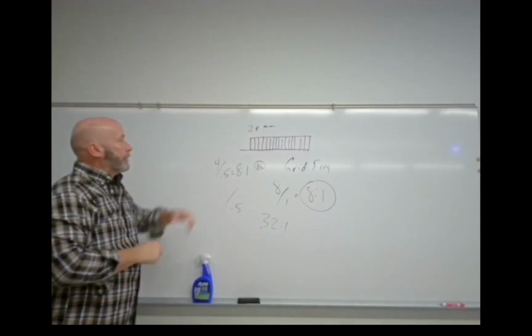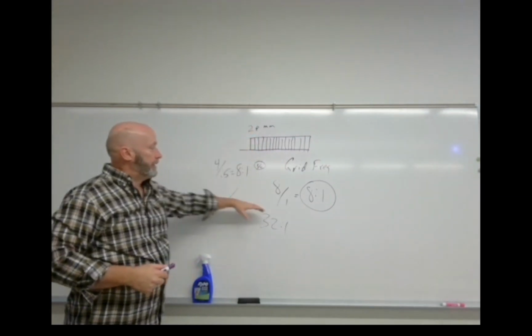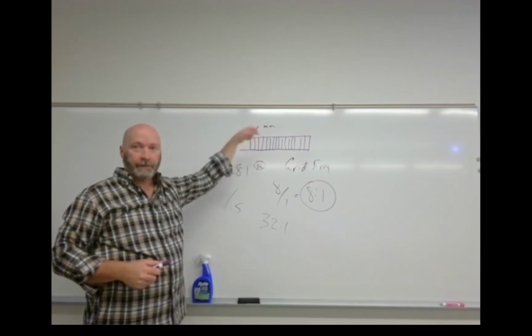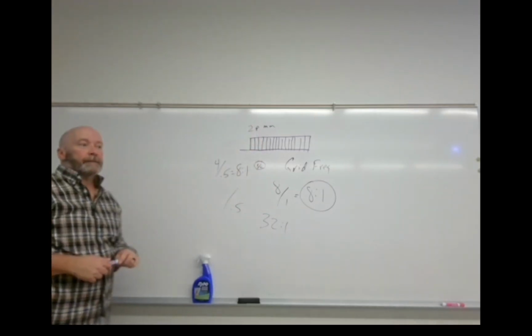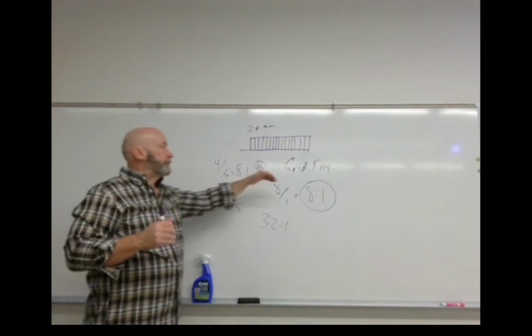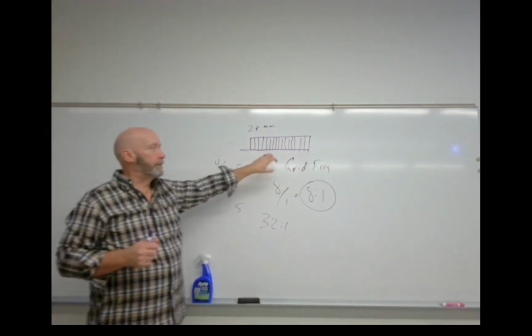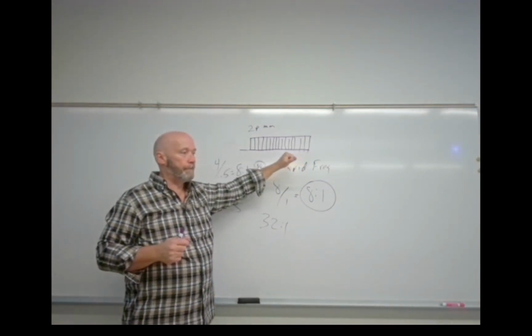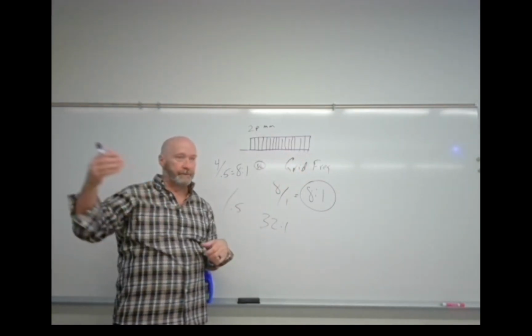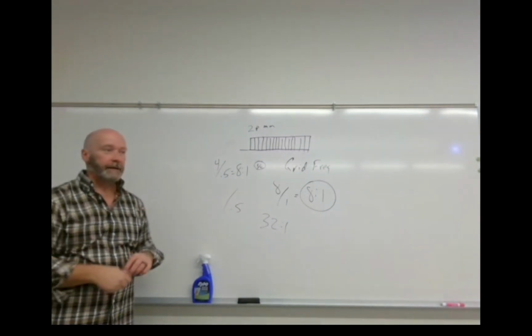So when we doubled our number of grid strips and cut the height down, we wound up with the same grid ratio, but with a higher grid frequency. Okay, so you're going to run into some questions on grid frequency and where grid frequency played a part in the evolution from screens and films to especially CR imaging.